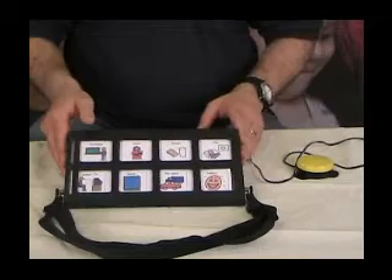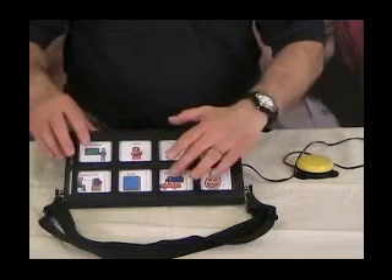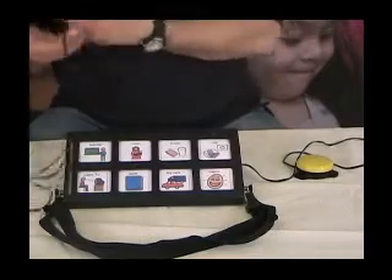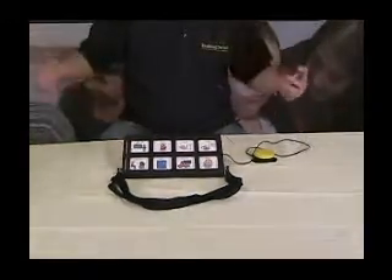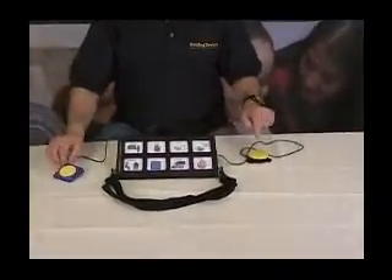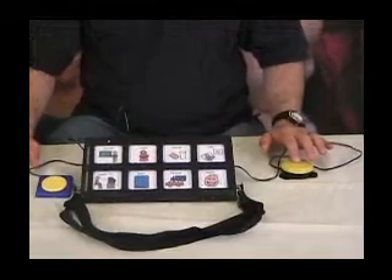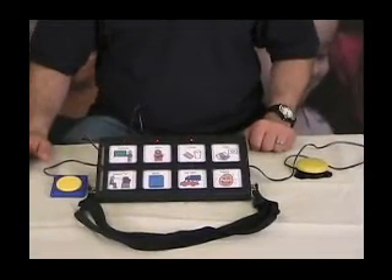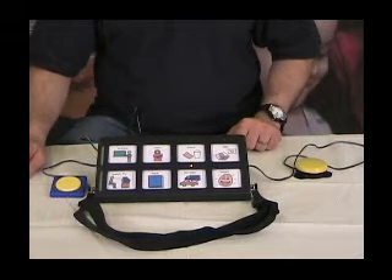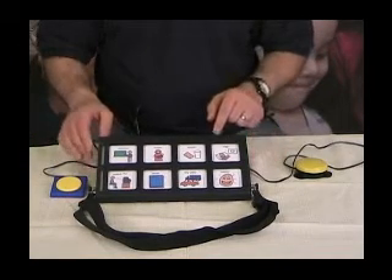The next mode is two-switch auto scan. Press cells 1 and 7 to advance to mode three. You'll need a second switch plugged into the second jack on the back. The first switch will start and stop the scan, and then the second switch will play back the message — for example 'Toy cars.' You can also use auditory cueing with this mode.